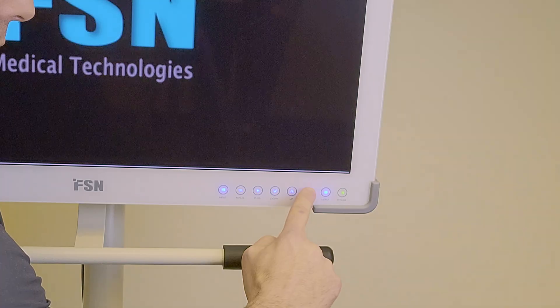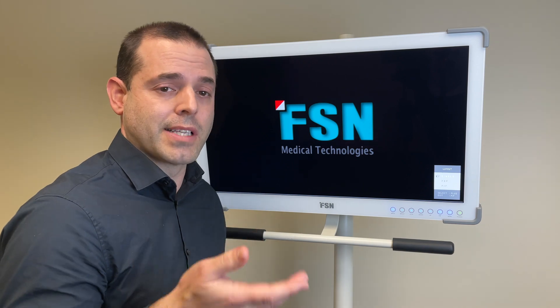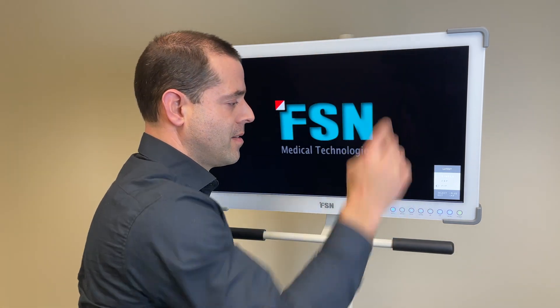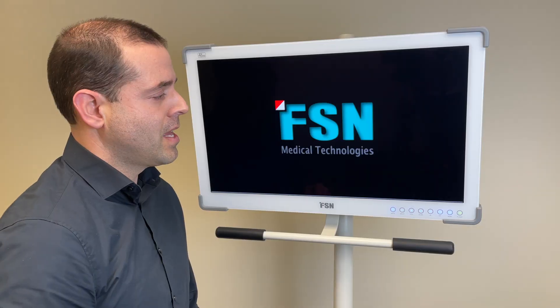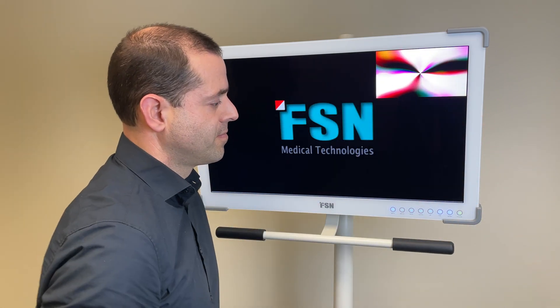Picture-in-picture: we have two different video sources going into the display and we want to see them at the same time. Go ahead to picture-in-picture, which shows one big picture and a small picture in the top right. Select it — in this case we have our DVI up here and HDMI here.